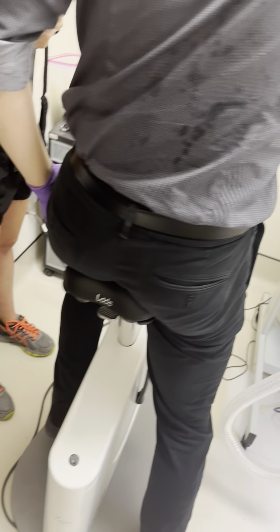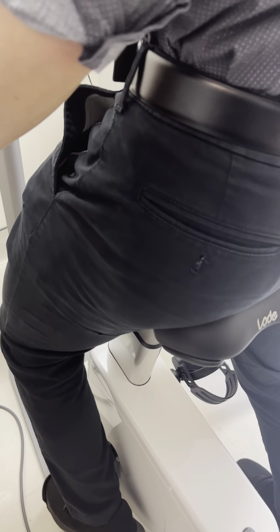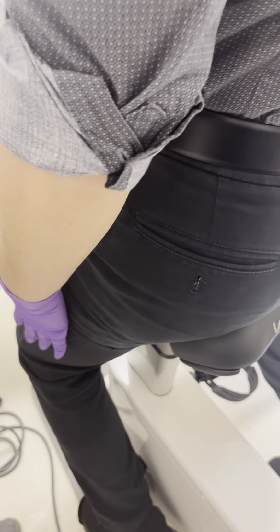So when the subject is at the bottom of a revolution, there has to be a certain angle to the knee, and so that's what you're going to have to look out for. So you should do this before proceeding with the test, just to make sure that the seat height is good.